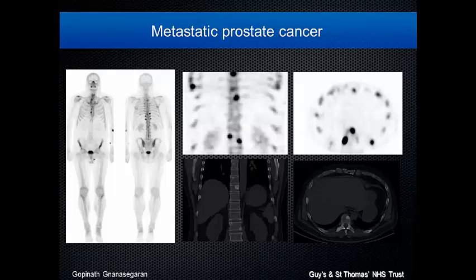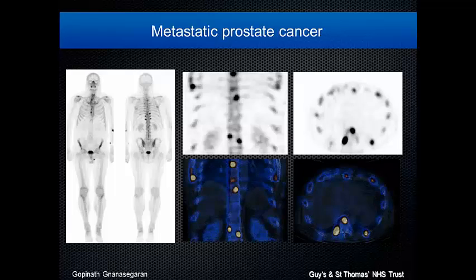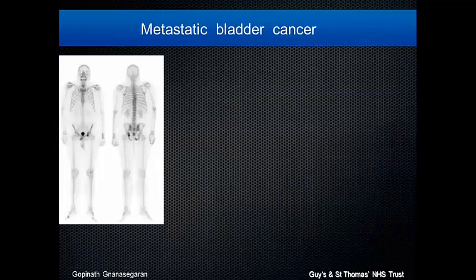I would have said, because it's mostly towards the costovertebral junction, it's quite tricky, but in this case, all the lesions turned out to be sclerotic, and it was positive on the bone scan. So I could make a definitive diagnosis rather than just on the bone scan. The sternum gives it away. There are two foci. It's definitely going to be metastasis, and the ischium also will have metastasis. But the question in the spine, out of those 10 lesions, how many are benign and how many are metastasis is challenging. So with SPECT CT, you can get a definitive diagnosis.